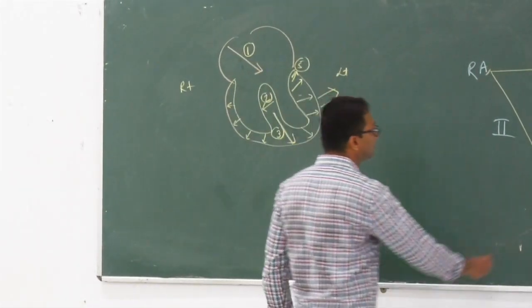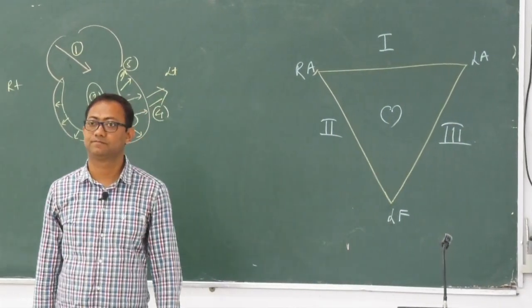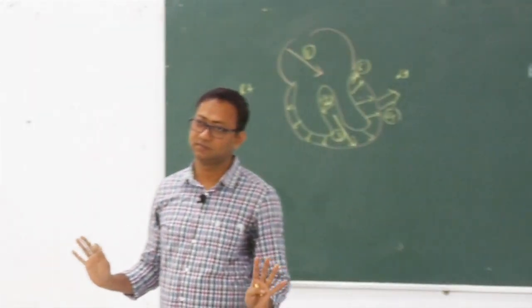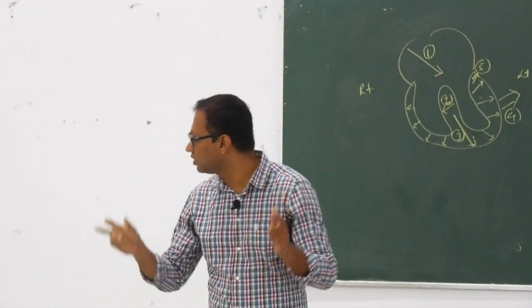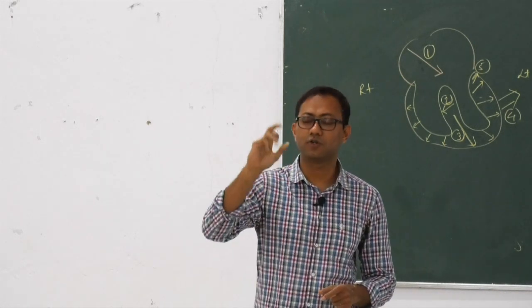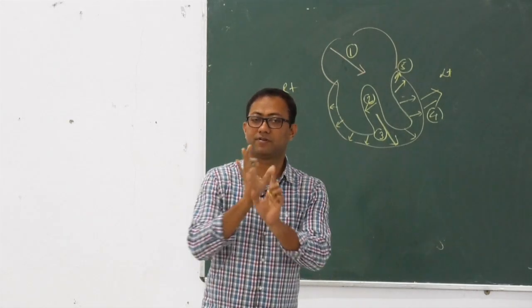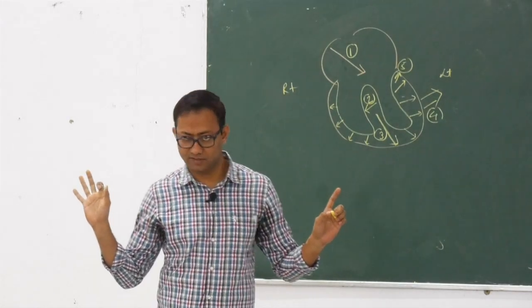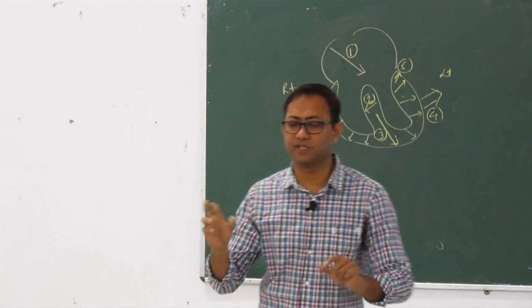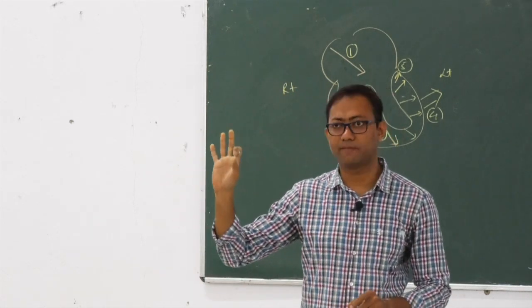And similarly, this is lead 3. Right? So we need 2 copper wires and a voltmeter to create a lead. So we have manufactured the device. A very basic device for lead 1, lead 2, and lead 3 we have manufactured.